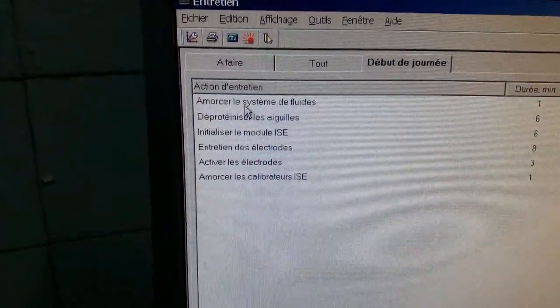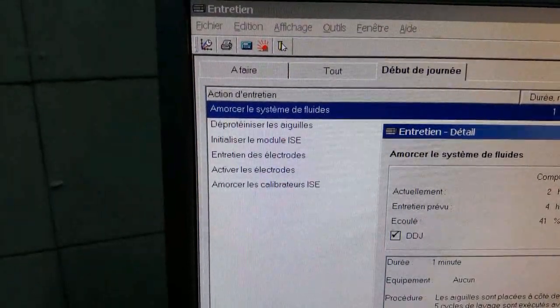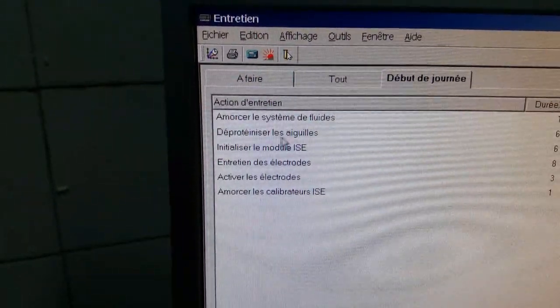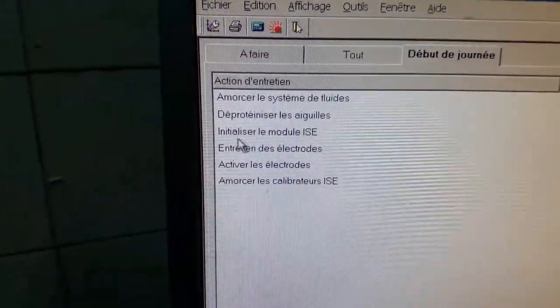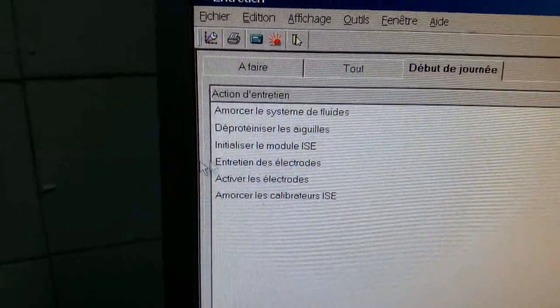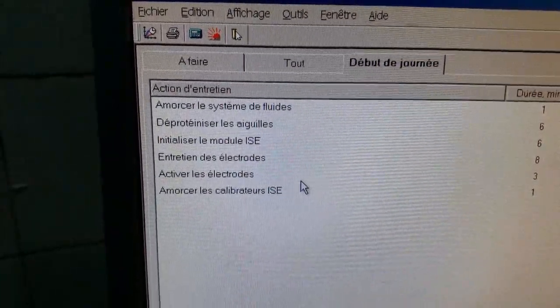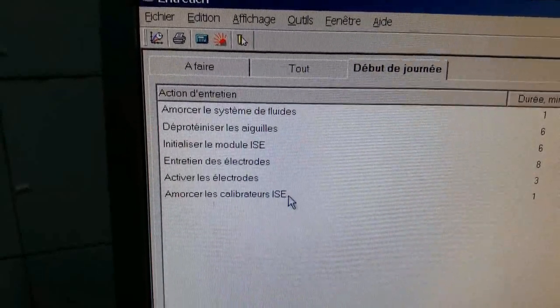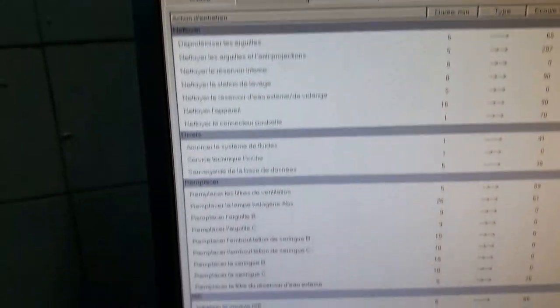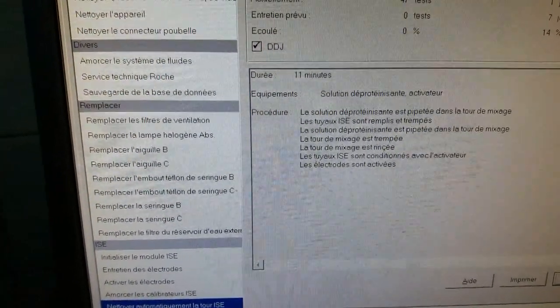De début de journée, il faut amorcer tout d'abord le système de fluide — il faut juste appuyer et exécuter. Déprotéiniser les aiguilles. La troisième action, c'est initialiser le module ISE. Entretien des électrodes. L'activation des électrodes. Et enfin, l'amorçage des calibrateurs ISE. On peut aussi effectuer le nettoyage automatique de la tour ISE.